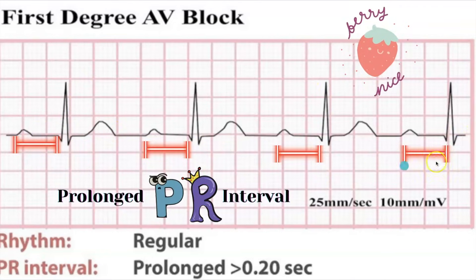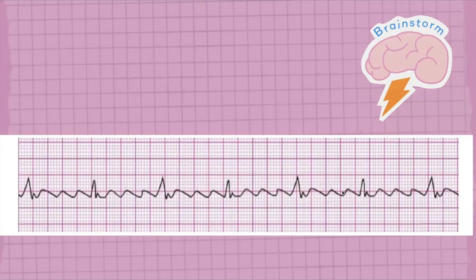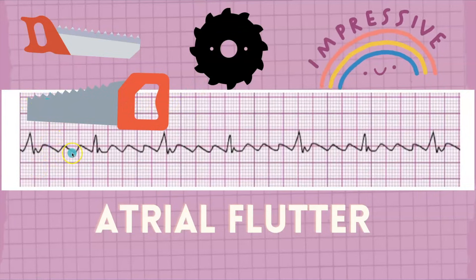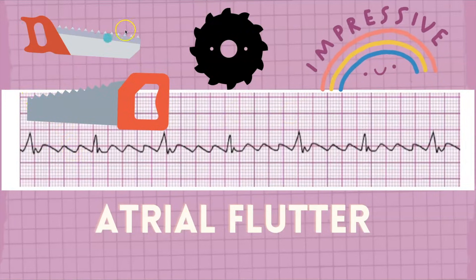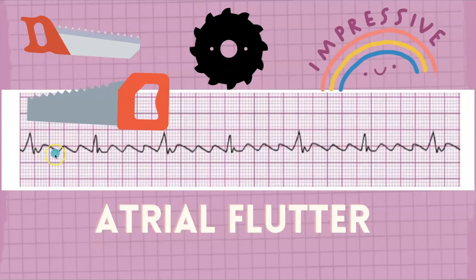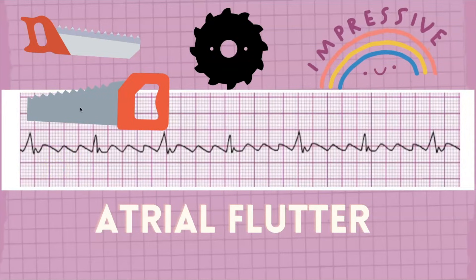This one is fairly easy to discern because of the type of P waves you see here. If you said atrial flutter, correct! Atrial flutter has this sawtooth pattern — boom, boom, look at that sawtooth pattern. It kind of looks like a dolphin fin or a shark fin — but what they call it is a sawtooth pattern.